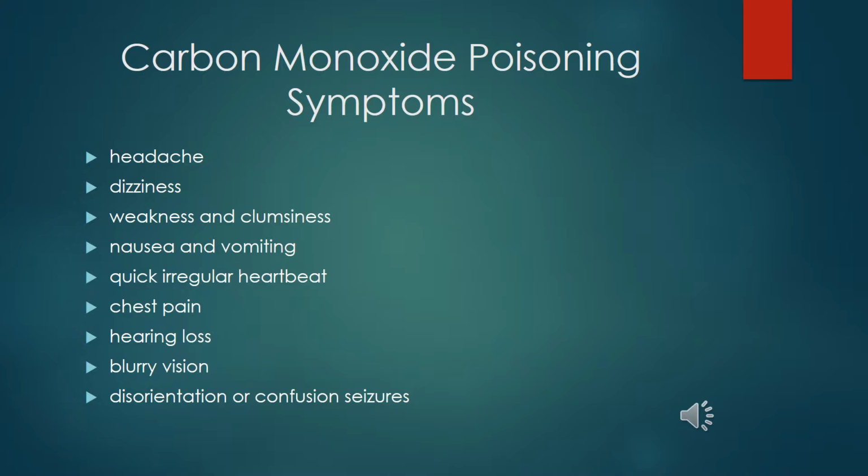look right, and they're sitting in the emergency department or they're sitting out in the field, particularly in wintertime around these parts when we just turn on our heaters, or if you have an exhaust problem with your car, it's important to get a measurement, a screening of the carbon monoxide levels and rule that out as a cause, because the treatment, like I said, is oxygen, so it can easily be reversed once it's detected. But if you take another pathway, treating their headache as if it's just a headache, you can delay treatment, and that's a bad thing for our patient.